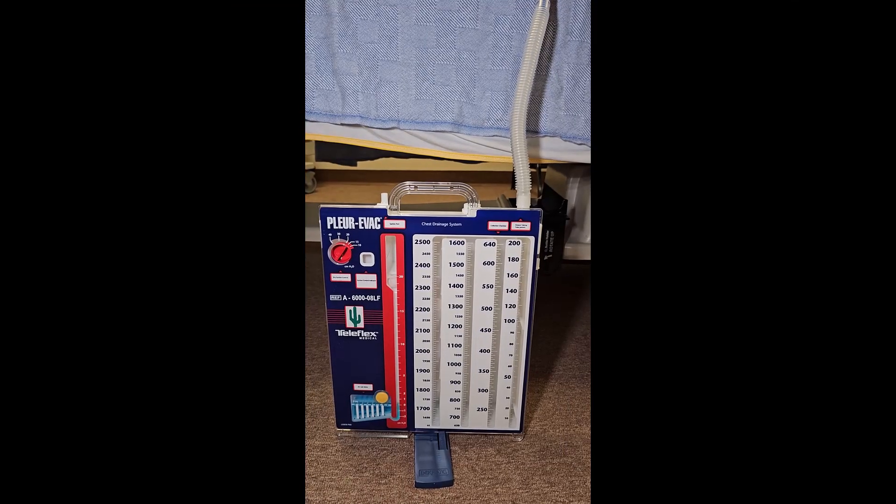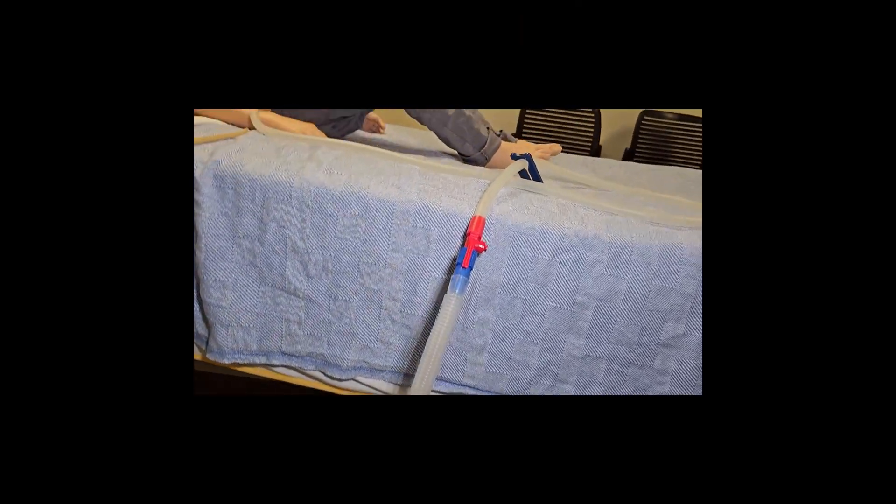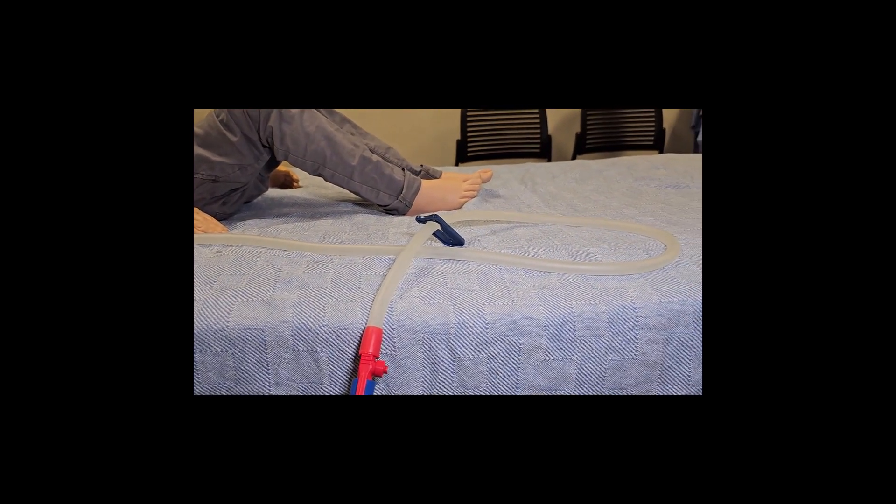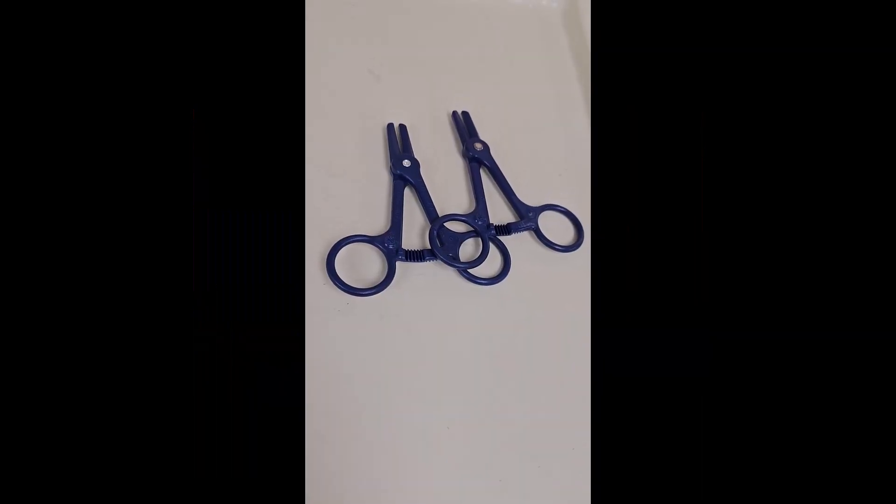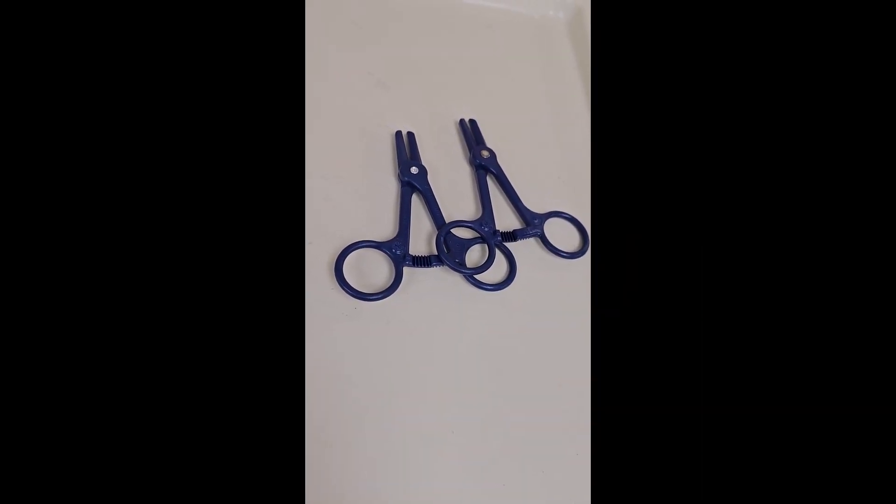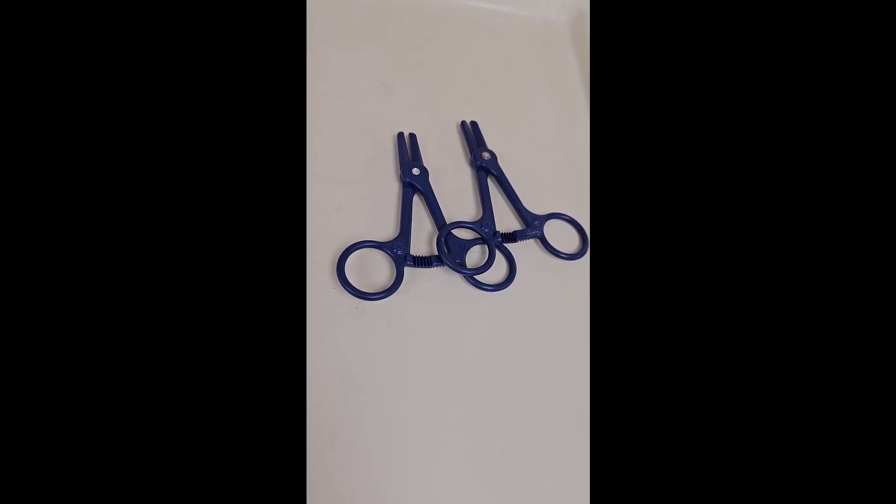And a couple of final tips: make sure your tubing is up on the bed so you don't end up with dependent loops, and always keep a pair of toothless clamps at the bedside as part of your safety equipment.